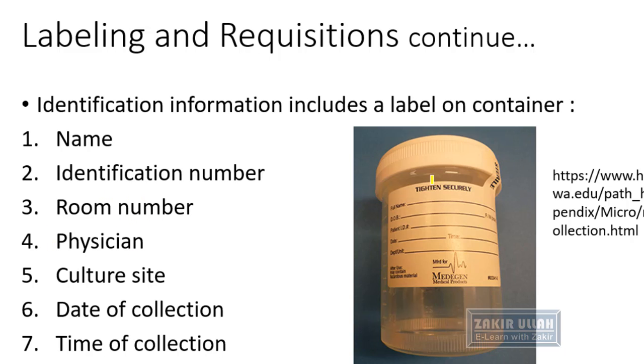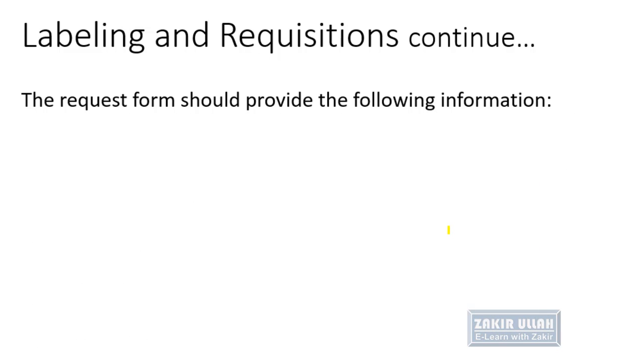All this information should be mentioned on the container, or on a culture swab or something like that.